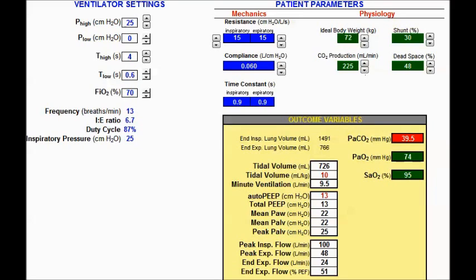I am introducing the airway pressure release ventilation simulator. This is for a study evaluating three methods to set t-low. On the left-hand portion of the screen are the ventilator settings. Some settings will stay constant across all three tests: p-high will remain constant at 25, p-low will vary, and for the first two methods I am going to use a p-low of 0. T-high is going to stay constant at four seconds, which is a common setting for APRV.